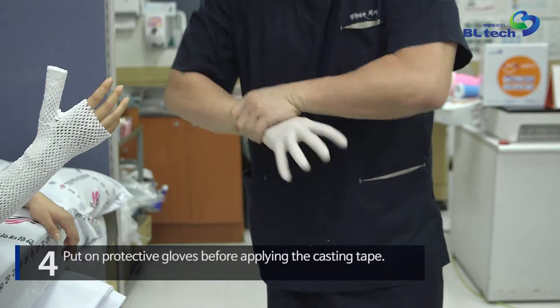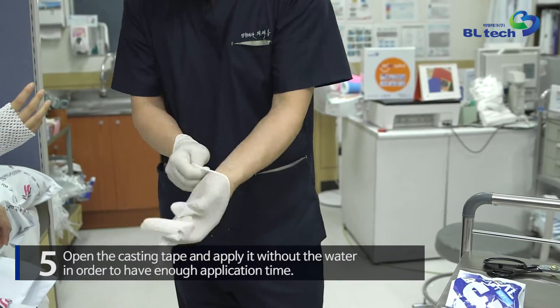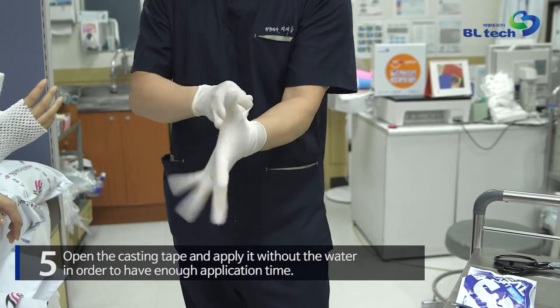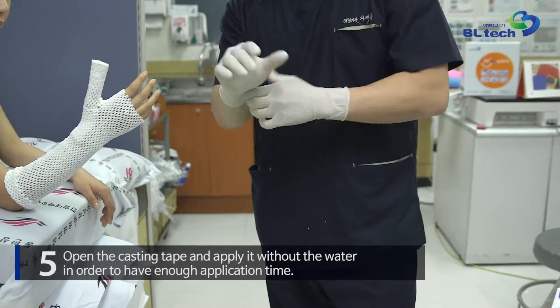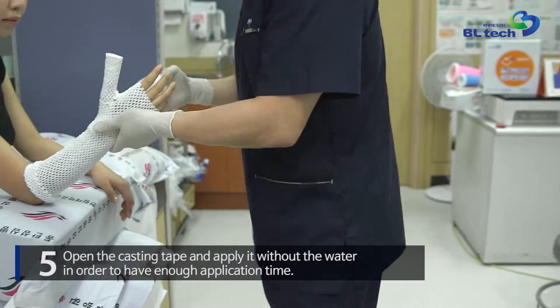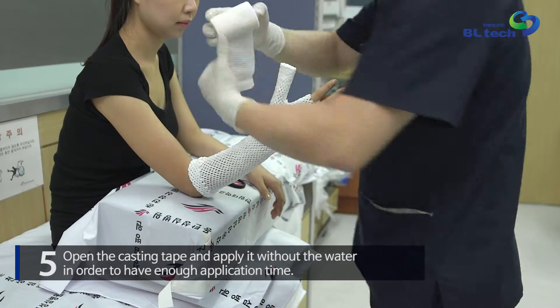Put on protective gloves before applying the casting tape. Open the casting tape and apply it without water in order to have enough application time. You may shorten the set time by dipping the casting tape in water. It is another benefit of Neal Cast to be easily unrolled without water.